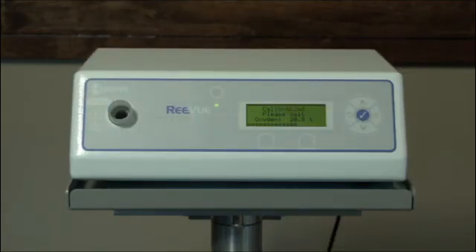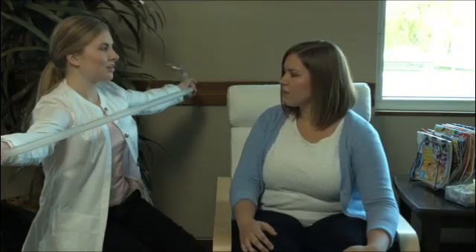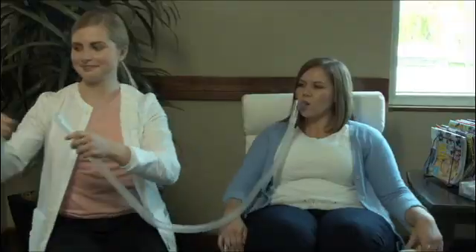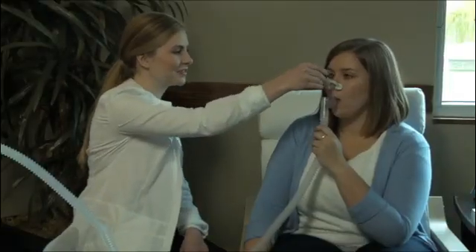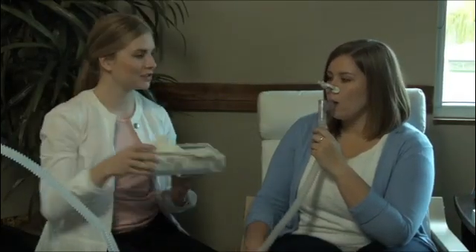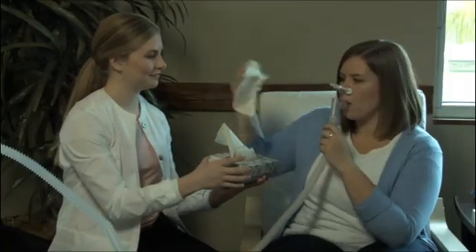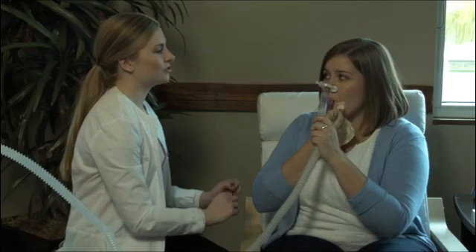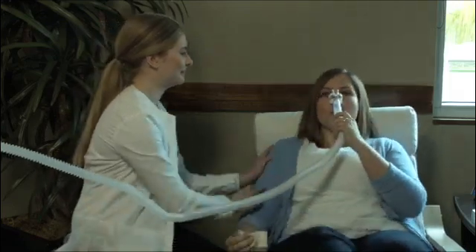When the unit indicates calibration complete, simply extend the metabreather tubing and have the patient make a nice seal around the mouthpiece. Put on the nose clip to ensure that all the air breathed out is analyzed by the Review. Let the patient know that if they need to remove the metabreather once or twice during the test to swallow or moisten their lips, it won't affect the accuracy of the test.